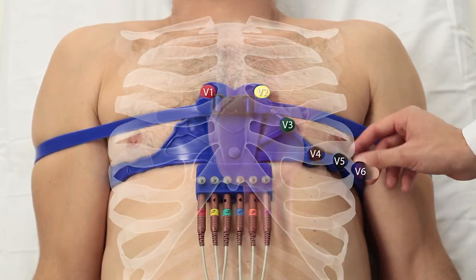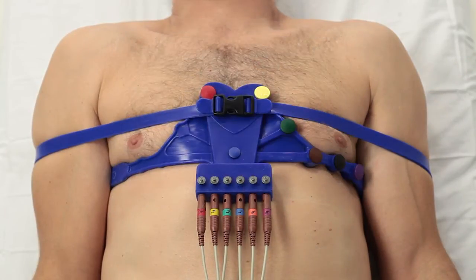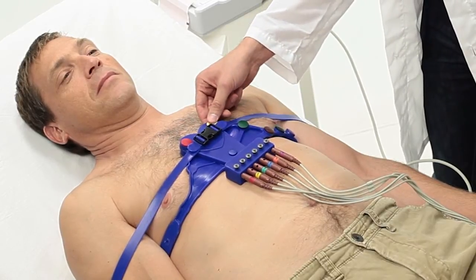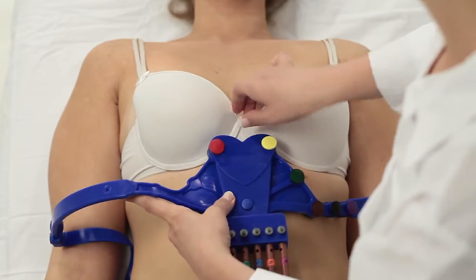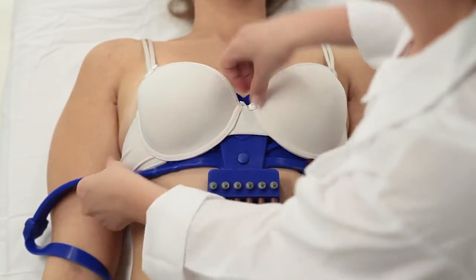Confirm V6, V5, and V4 are located beneath the breast. Confirm that all electrode surfaces are in touch with the body. For women, follow the same process while placing the belt underneath the bra.